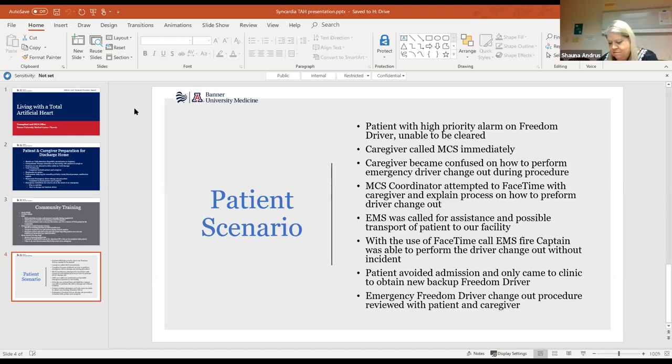Just for prophylactic? Yes. We use a red one and a blue one, so it's on each side. The red kind of helps them distinguish if those little red tape pieces fall off, which side is red and which side is the blue.